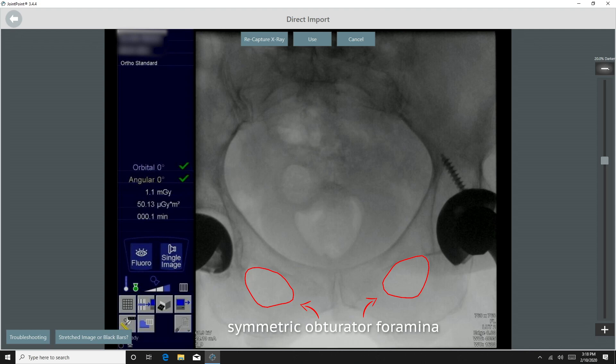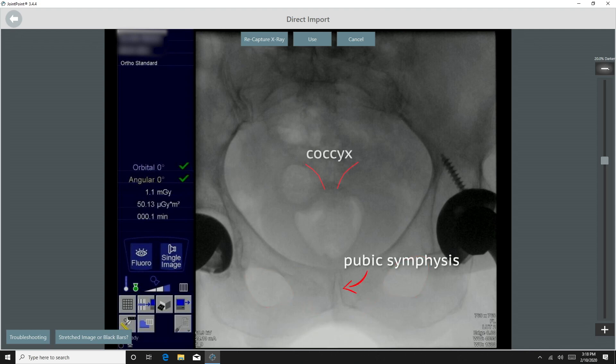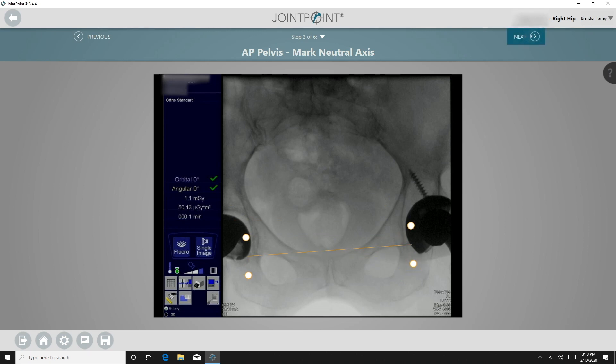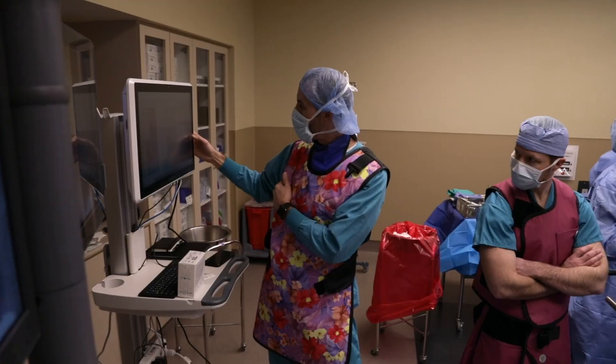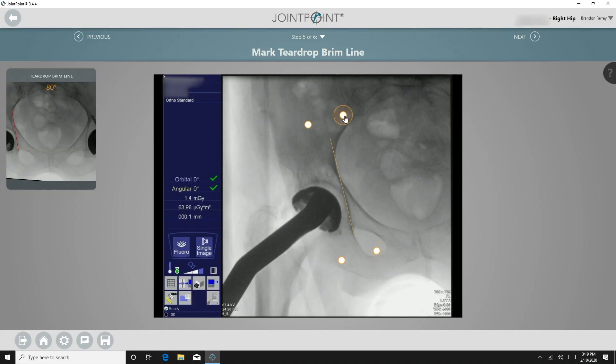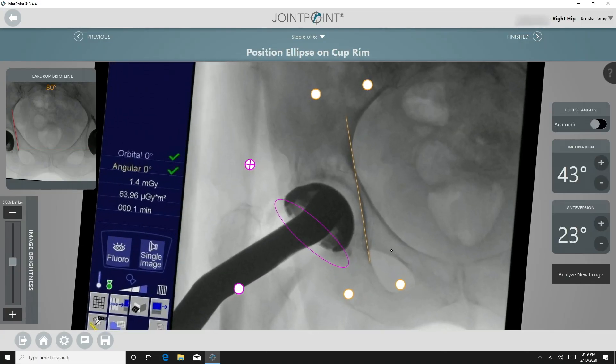I verify that the pelvis is neutral by ensuring that the pubic symphysis is aligned with the coccyx. This image is then used as the neutral reference point for placement of the cup. I then bring the C-arm to the same position over the center of the acetabulum and analyze the cup position using the software.